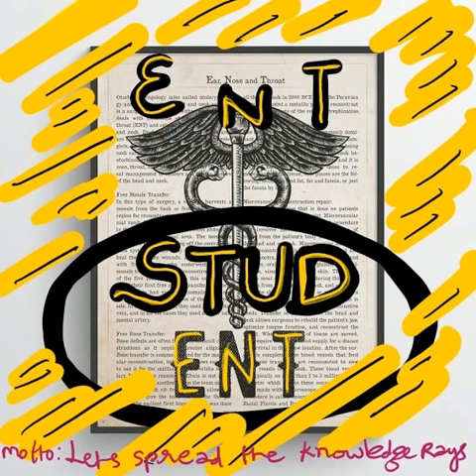First cut is marked along the linea temporalis, that is, the ridge of bone extending from the superior border of the zygomatic arch posteriorly onto the mastoid cortex. Second cut is posterior and parallel to the posterior meatal wall towards the mastoid tip. Remember the 3 P's: posterior and parallel to the posterior meatal wall.